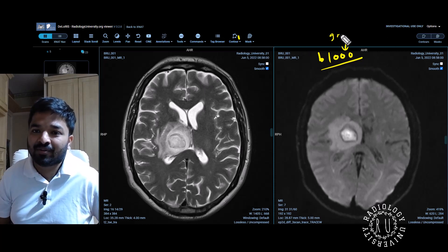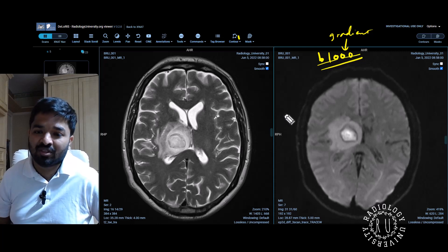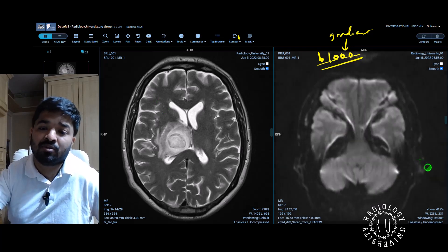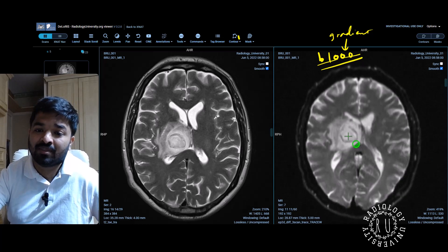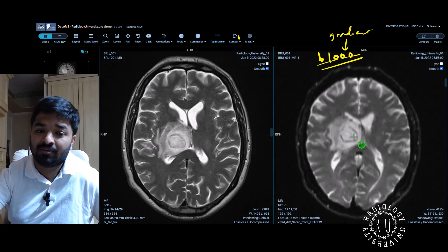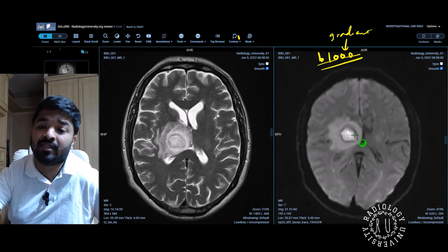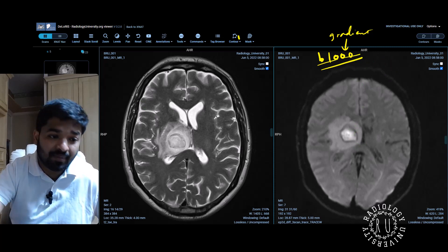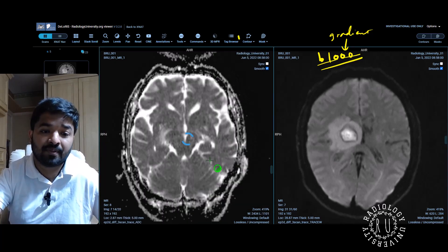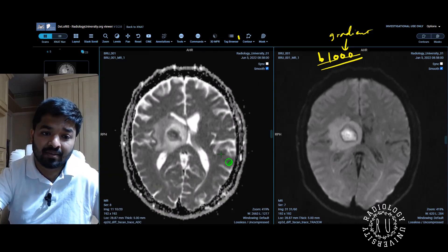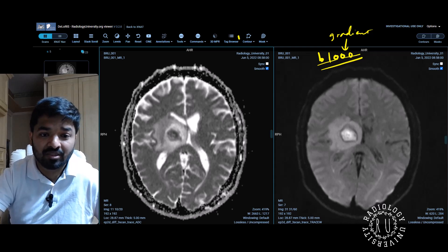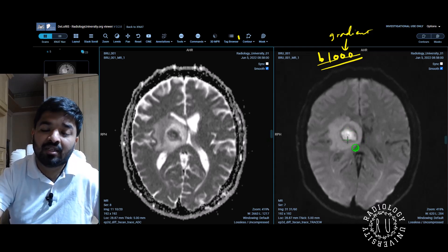When you go from b0 to b1000, you want to see whether there is diffusion restriction. Even without an ADC map, you can fairly comment just based on b0 and b1000. If something is bright on b0 and is not losing its signal intensity on b1000, you are fairly certain it will be low on ADC. And here is the ADC map — there is diffusion restriction in the center of the lesion.